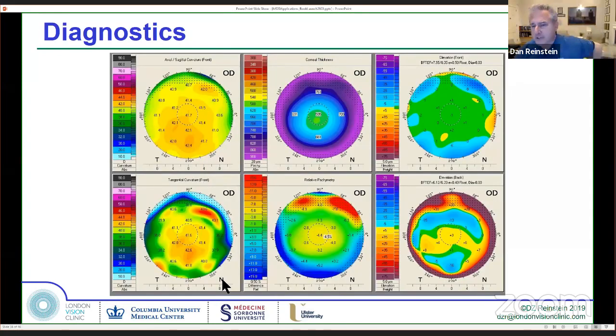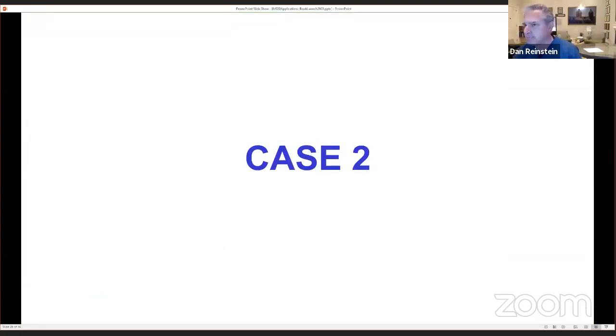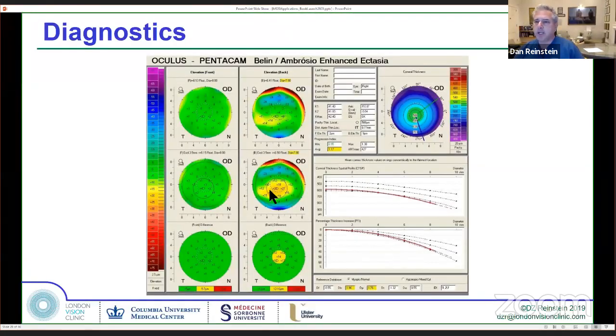Then we can move into 2006 and we can look at the Pentacam. Well, what do we think of this? Well, it's a thick cornea and the back surface is a bit wonky. Oh, look, that's front, back. I don't know. Tangential. I don't know. What do you think? And then you have these big forums and big courses where 25 people are giving their opinion about this thing. And everyone's like, I would have done this and I would have done that. And all you have to do is look at the epithelium. Okay. And by the way, that was just epithelium.